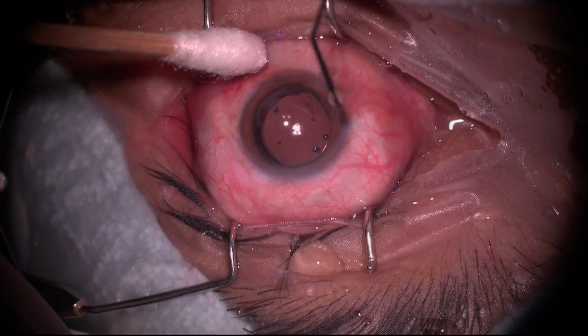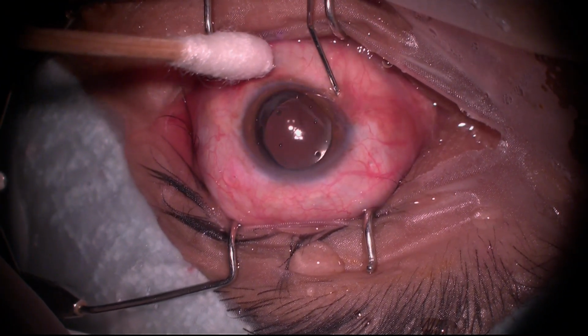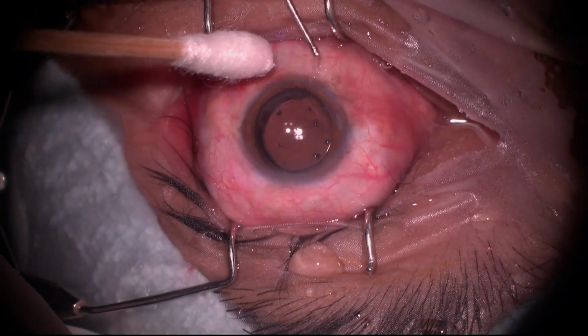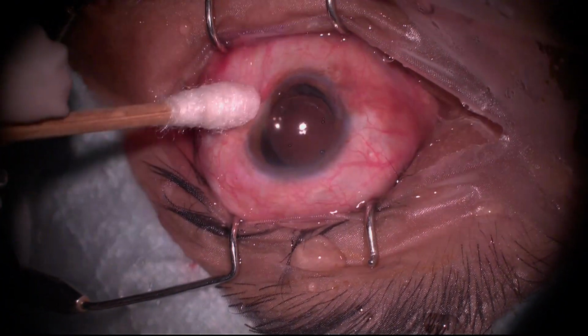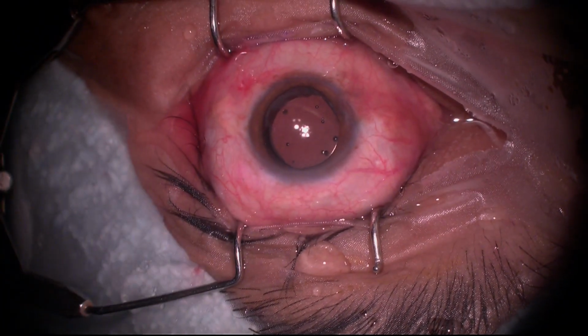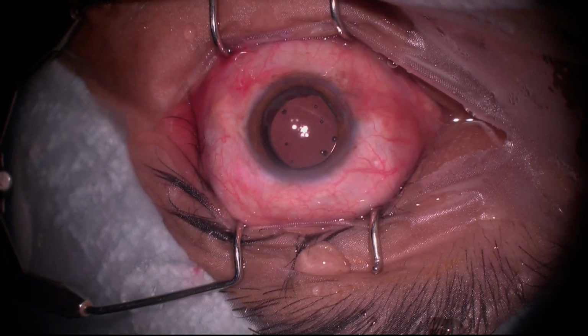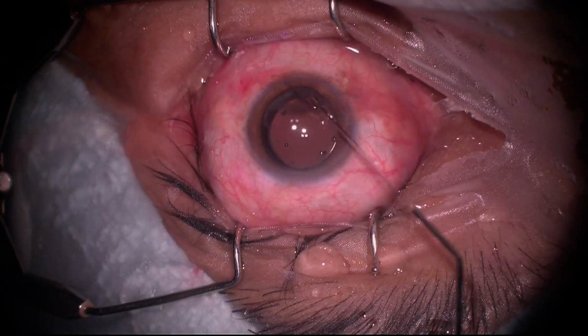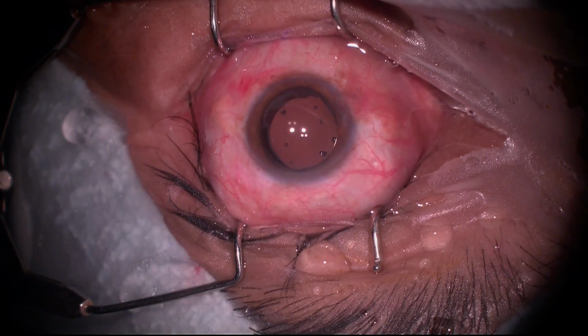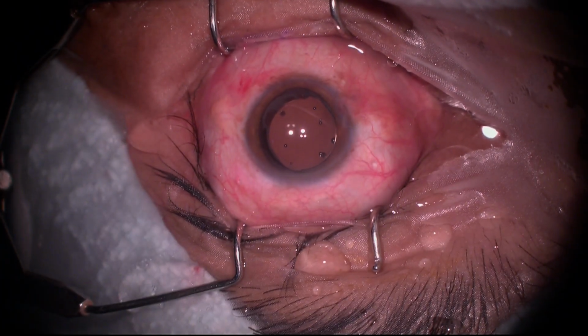There's an adhesion in the at the fornix. See that space? Normally ये होना चाहिए नहीं होना चाहिए. Should pterygium have that space?